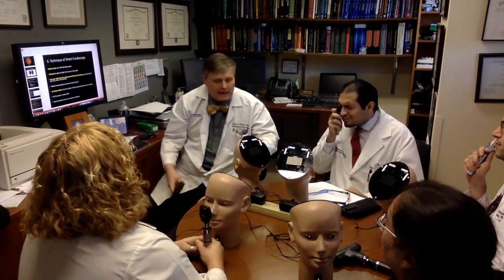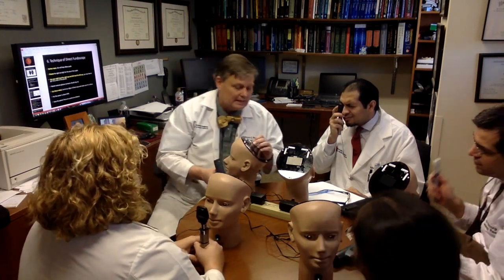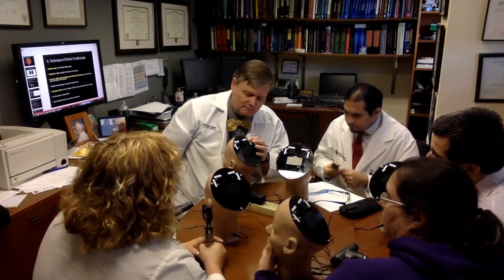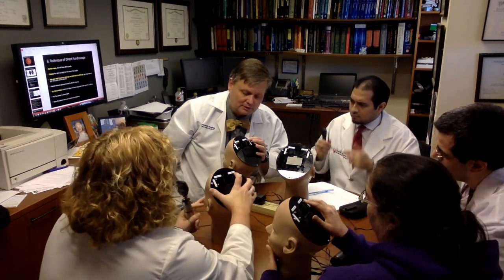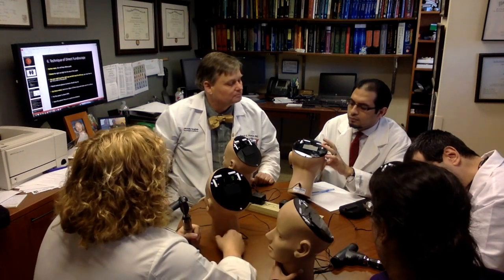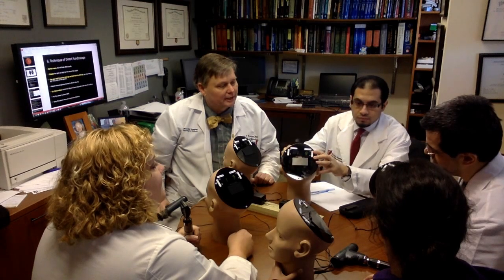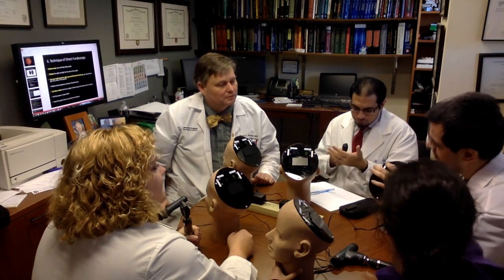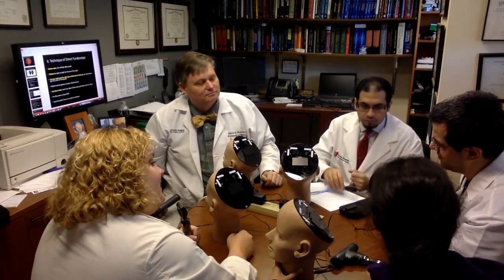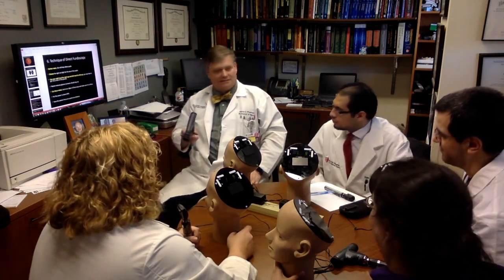Then, as I mentioned, you put the power at about 80%. And on our simulators here, there is the power button at the top, which should be green. In the back are these buttons that go up and down. You're going to look at the right eye and put the button up to 9. So you tap 1, 2, 3, go up to number 9, okay? And it'll do the right eye. Okay, you're going at 9. Yep, now you're at 6. I've got to go up. Other button. No, you're the right eye. Over here. There, go up. There are up and down buttons. Plus, that's down. Keep going. Up, up, up, up. Good. Number 9. Excellent.